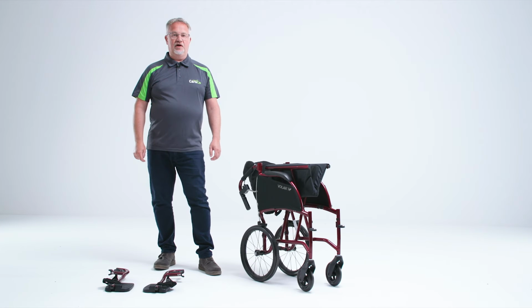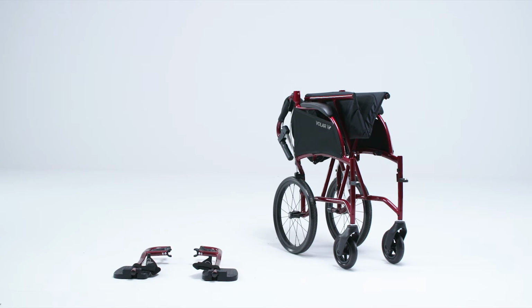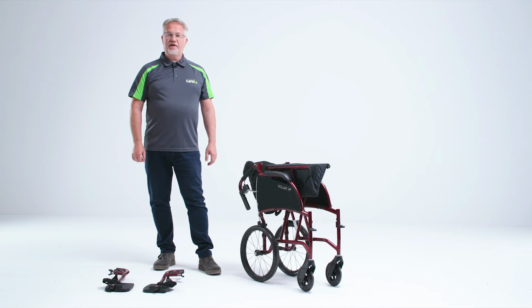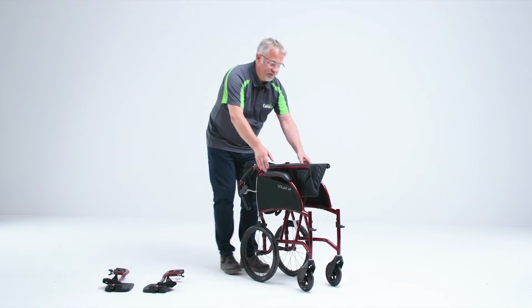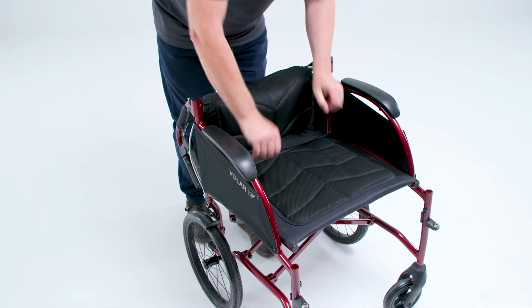Welcome to the assembly video for the VOLAR 10. Once you've taken all the items from the box and placed them in front of you, you should have the main wheelchair and the footrests. To put the item together, simply open out the wheelchair frame and push firmly on the seat. That clicks into position for you.